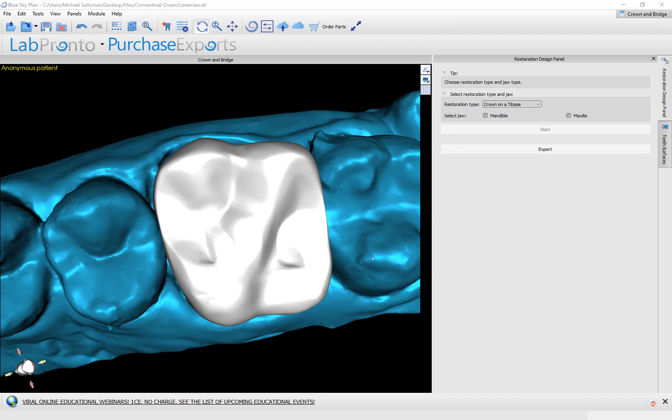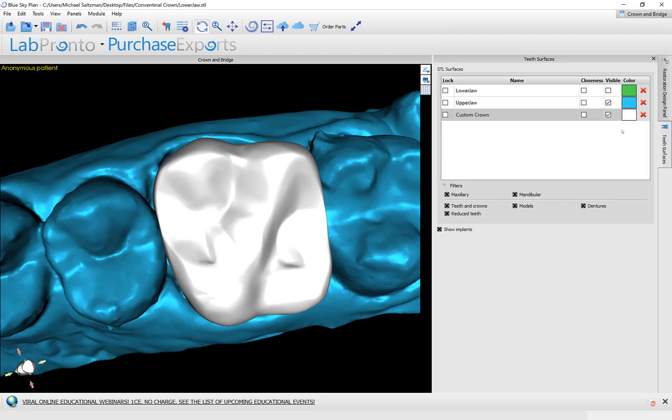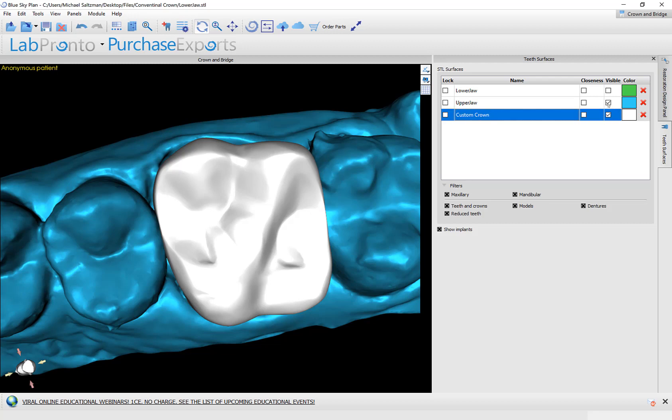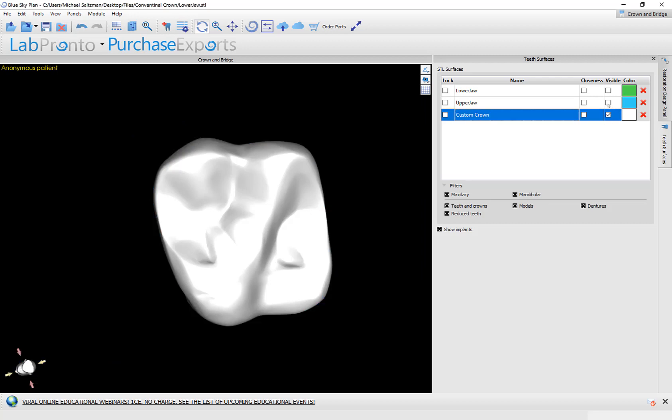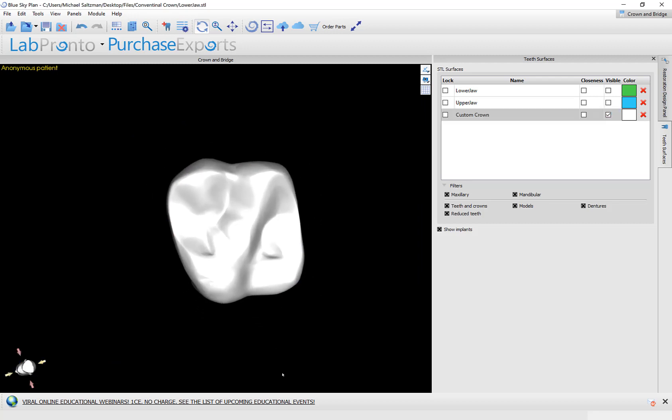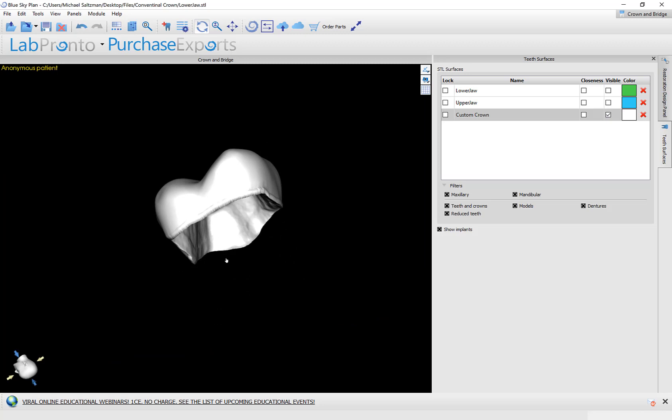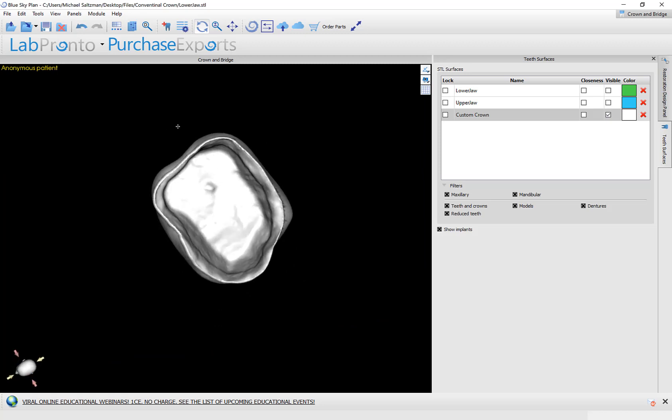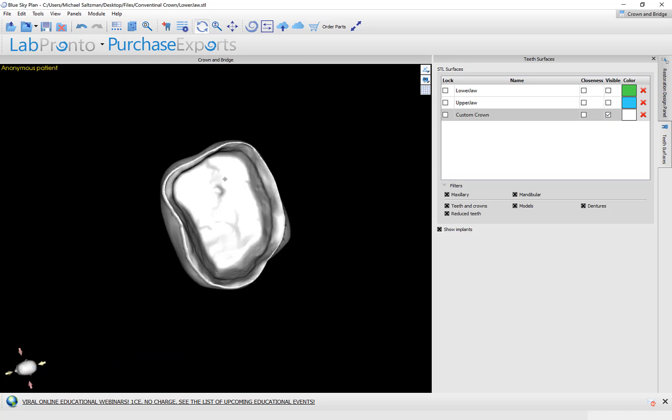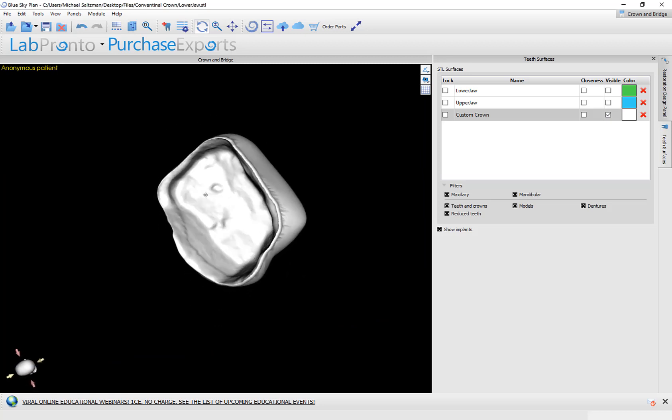So now we've finished creating the crown. We could switch over to teeth surfaces. We could see our crown that we've just created here as the custom crown. If we want to rename it, we could give it a different name. If we turn off the model, then we could go ahead and rotate and see the crown that we have just generated.